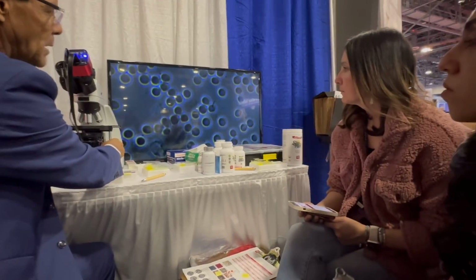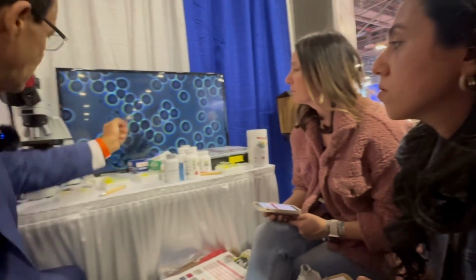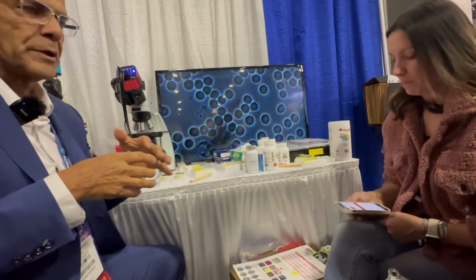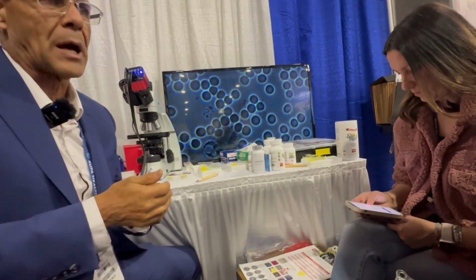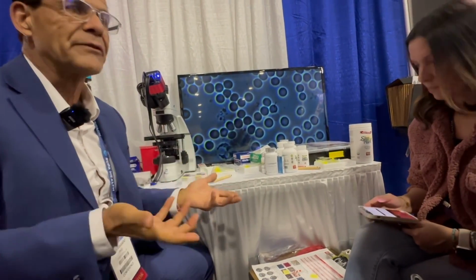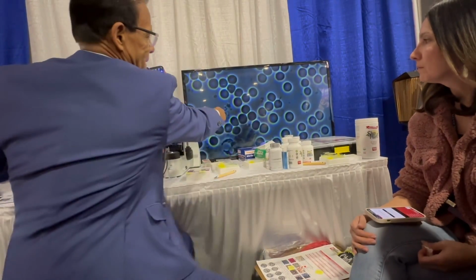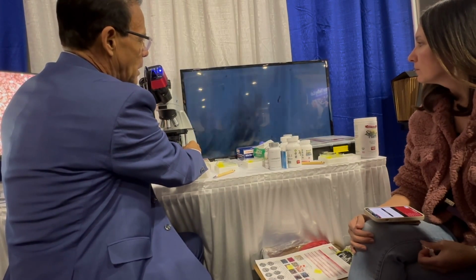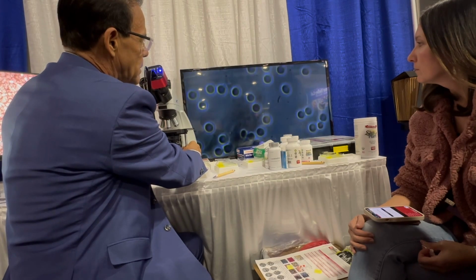Have we commented at all on your blood yet so far? Okay, a white blood cell that looks like it's broken, the broken end of it, so it's releasing some of the most powerful digestive enzymes of the body called lysosomes. So that can cause inflammation. Do you know of any inflammation in your body at all at this time? Okay. This is platelets. We all have a little platelets, and then I measure the degree of platelets and look if her red cells are round and uniform.